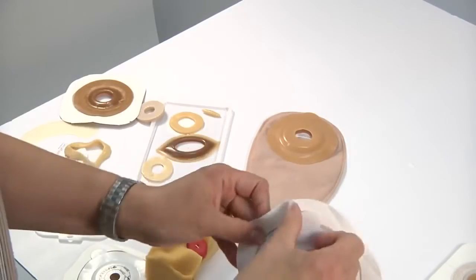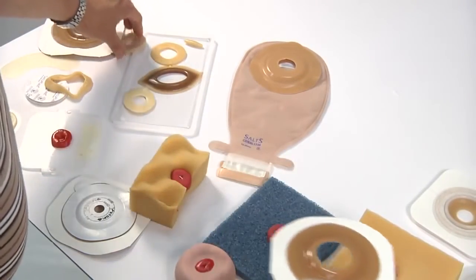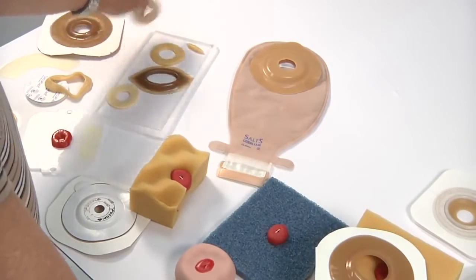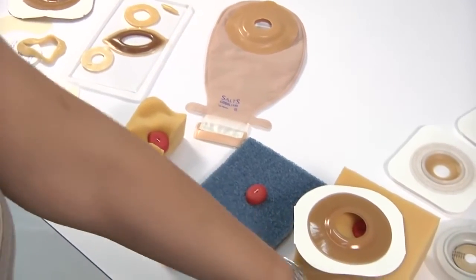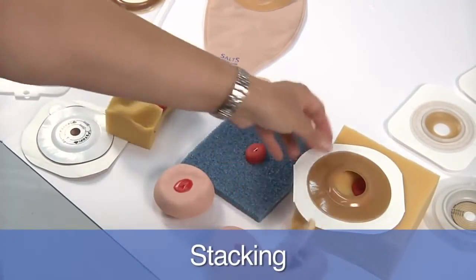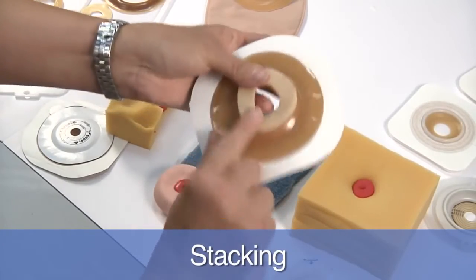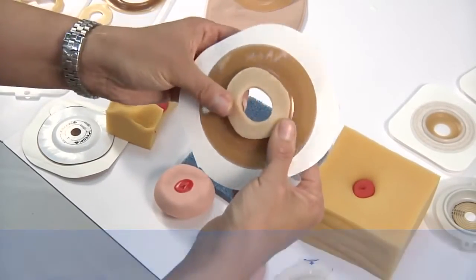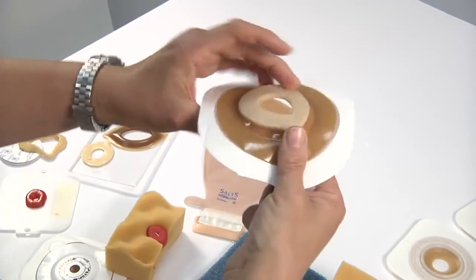And as with the flat, you can take the backing of this off, and you can actually take a ring and you can do what's called stacking, where you're actually going to distort the ring again into the shape and size that you want. And you would put it on the back of the barrier, and you're starting to build up even a little bit more convexity.